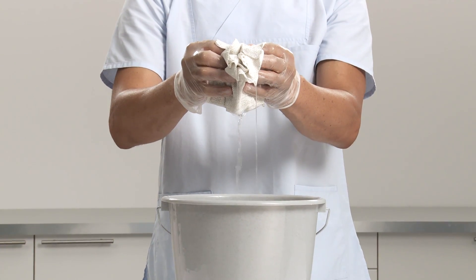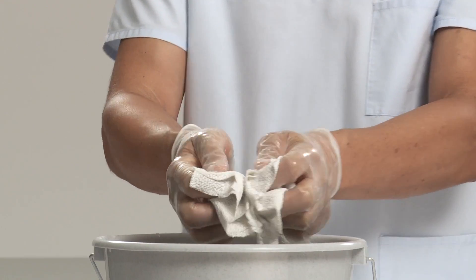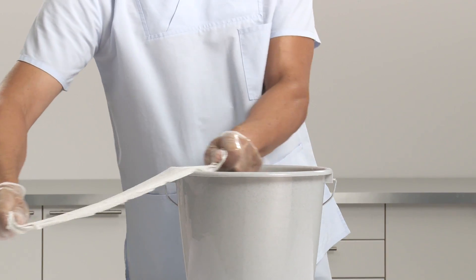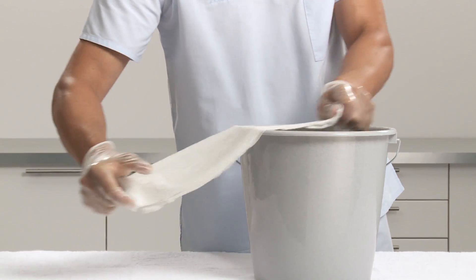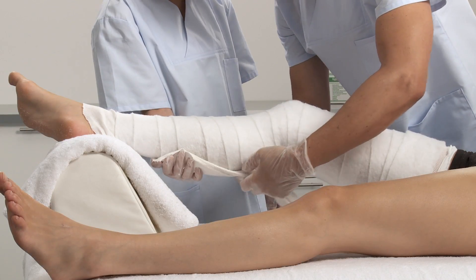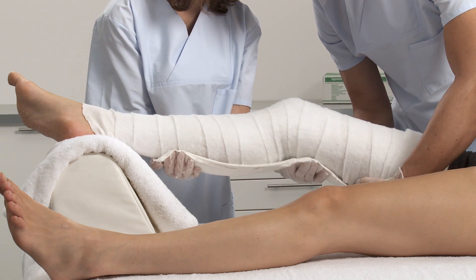Activate the splint by dipping into cool water, holding the ends and maintaining the splint fold. Remove from water and gently squeeze to drain. Straighten out the splint and run it over the edge of the bucket to smooth and dispose of surplus water. Apply the splint along the calf and back of the knee and thigh and smooth down.